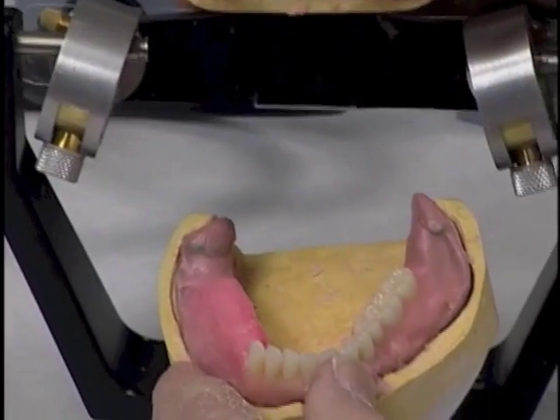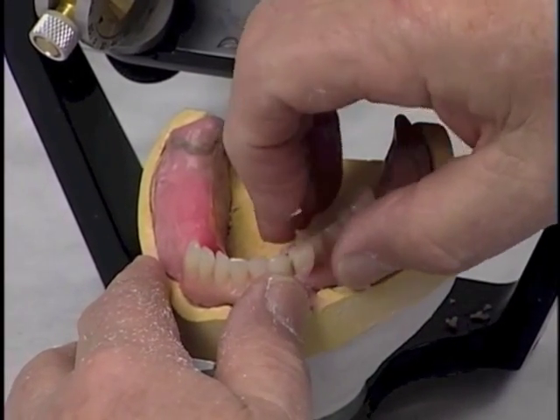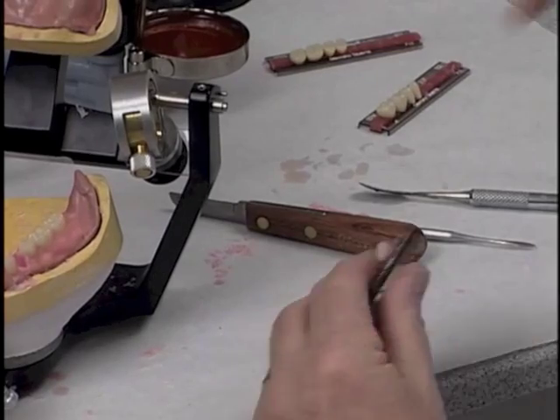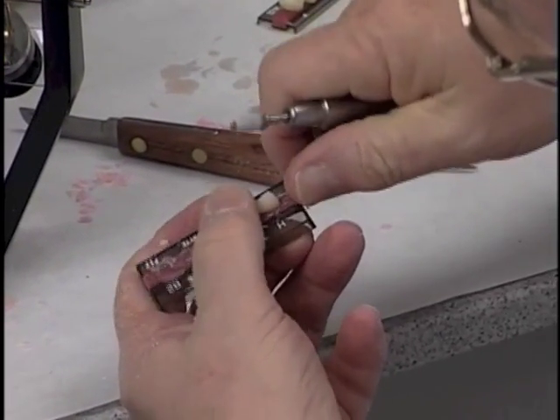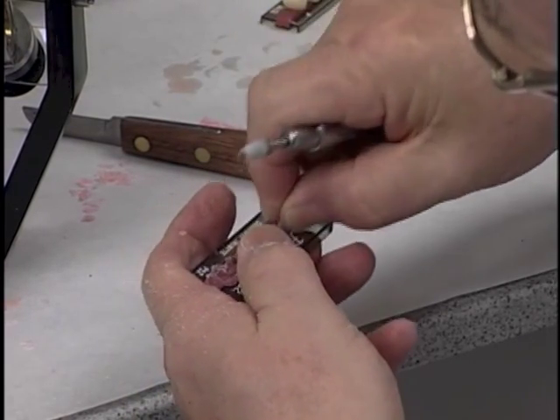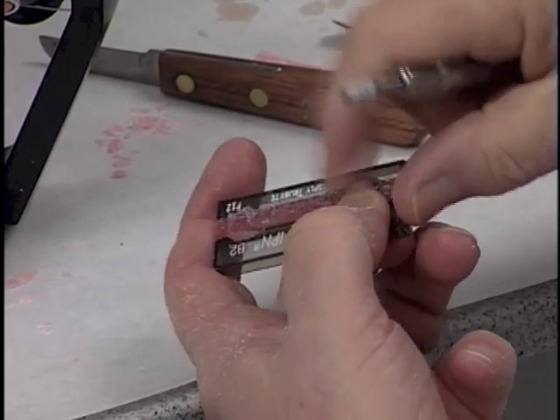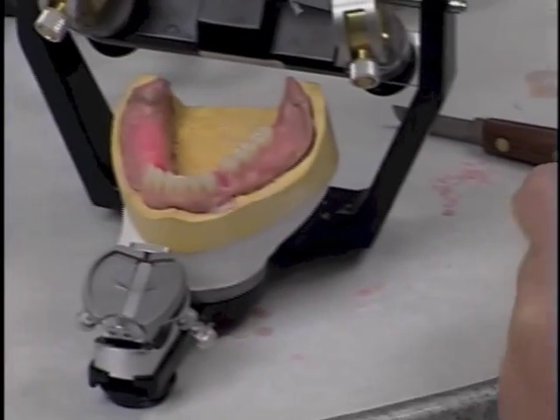The tooth is just a little bit too high at this point, and I think I need to grind just a little bit more on that tooth in order to get it to fit in there properly. Now that should fit into that space without a problem.